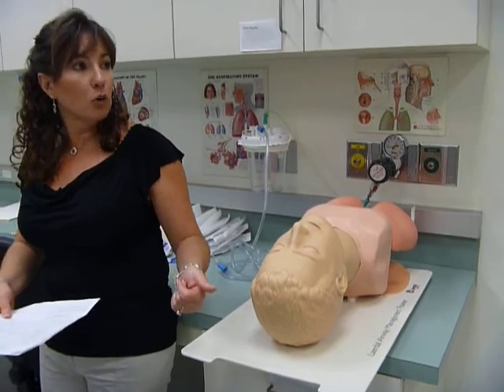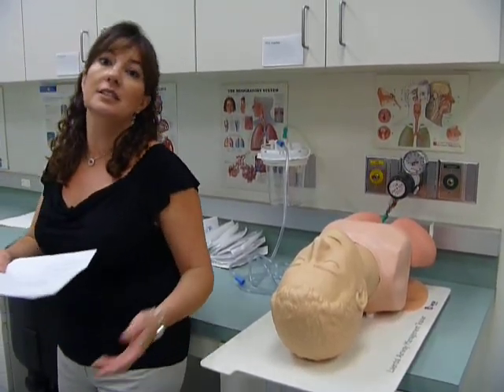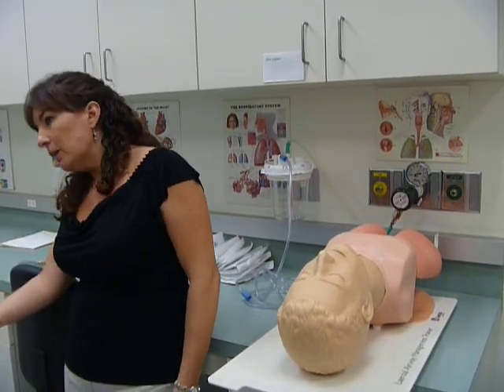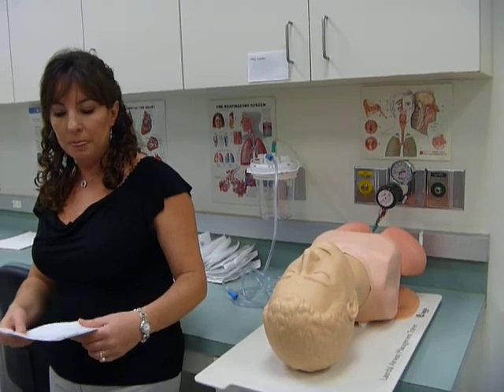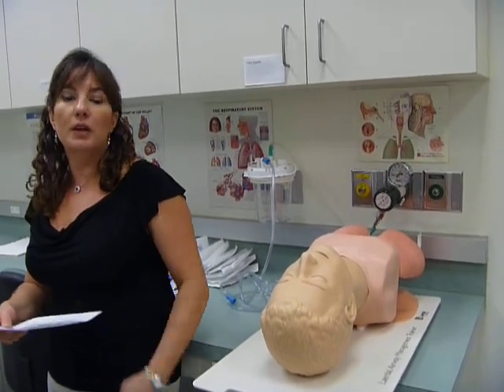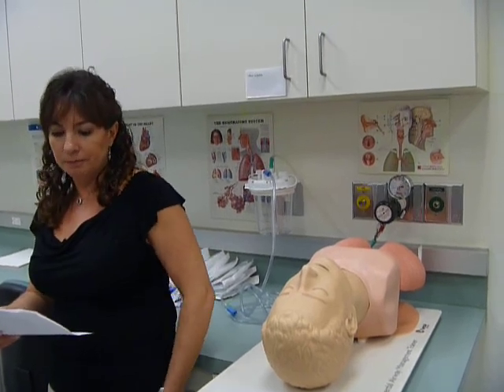They may have cardiac arrhythmias. The number one reason for cardiac arrhythmias is hypoxemia. So if I become hypoxic, I may end up with cardiac arrhythmias because of it, as well as hypotension. So a patient could become hypotensive while you do this.